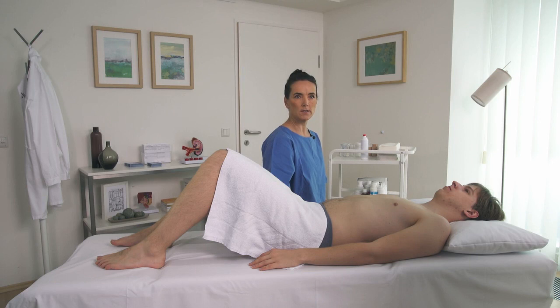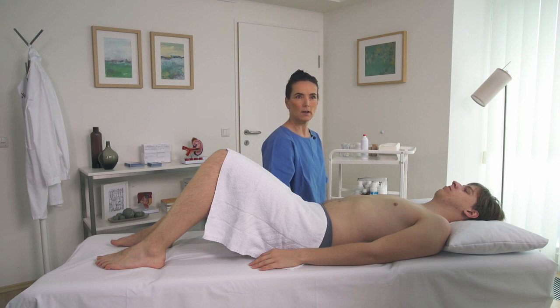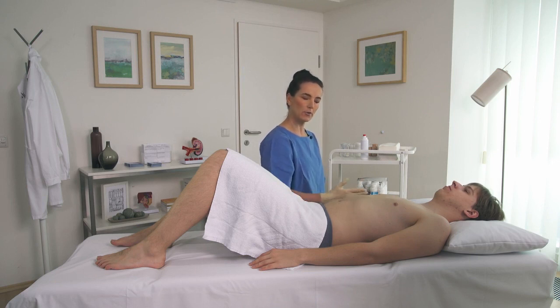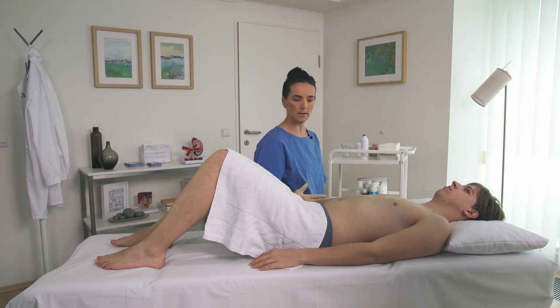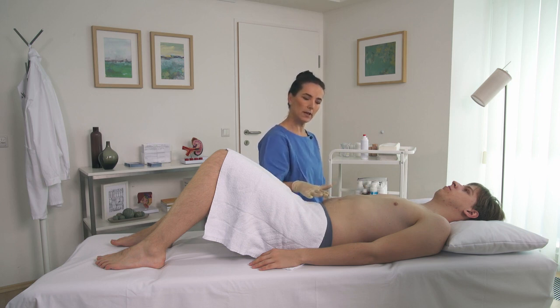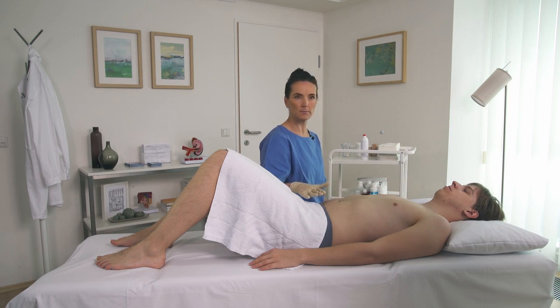To perform an accurate scan of the abdominal aorta, it's absolutely beneficial to place the patient in a supine position, as I did here, and to flex the knees to reduce the tension of the rectus muscle.